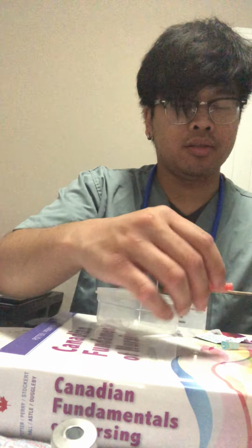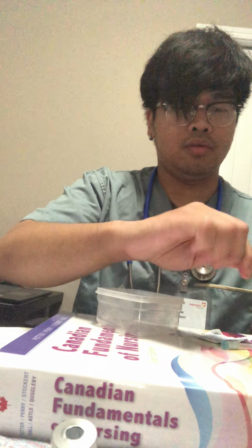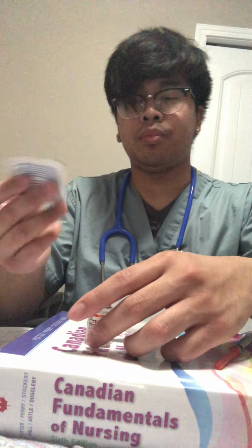First I'm going to apply hand hygiene, and then connect the syringe and needle. I'm going to apply an alcohol swab on my vial to make sure it's clean, and take the cap off using this method.